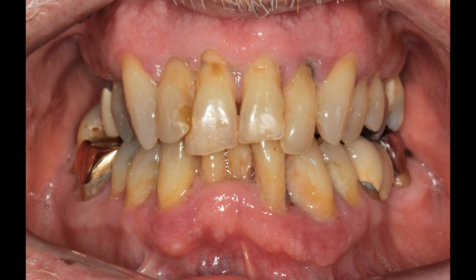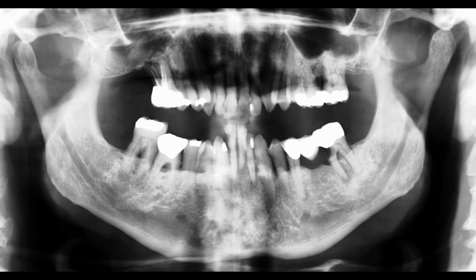So you'd think a case like this would absolutely have to have pink zirconia in it because he's already missing bone. But it's always remarkable to me that we're able to do these cases many times with this much bone loss and no upper pink zirconia. So you'll see as it progresses, this is how he came in. Here's his preoperative panoramic image.